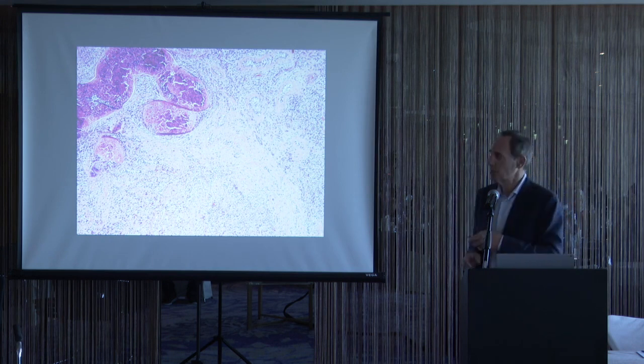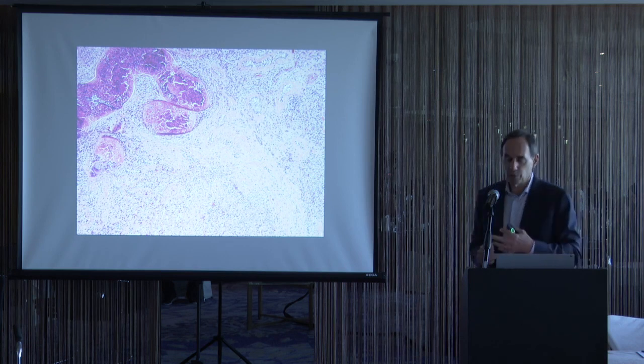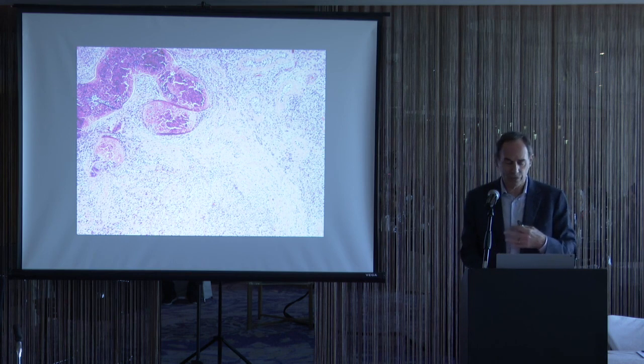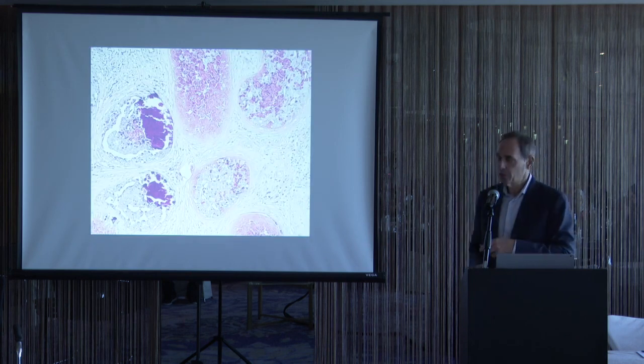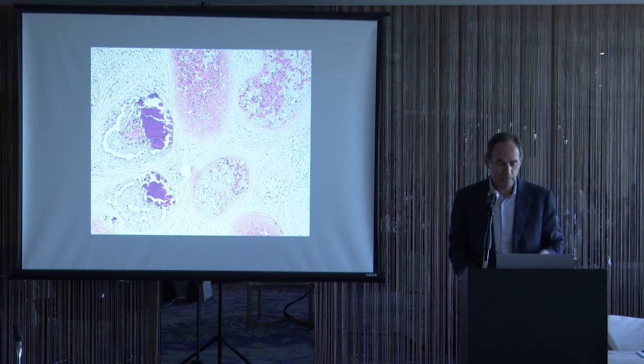Whenever you see this at low power, this bright pink necrosis in these tubular structures, that's intratubular embryonal carcinoma. It has a predilection for extensive necrosis. Here one can see a transition where one sees intratubular embryonal carcinoma with some calcification without as much necrosis, with some focal necrosis, and then finally what one often sees is just purely necrotic intratubular embryonal carcinoma.